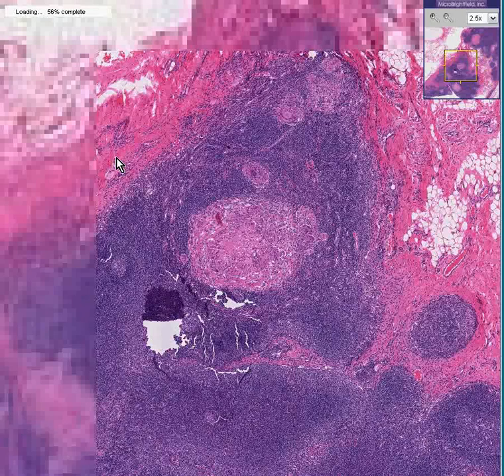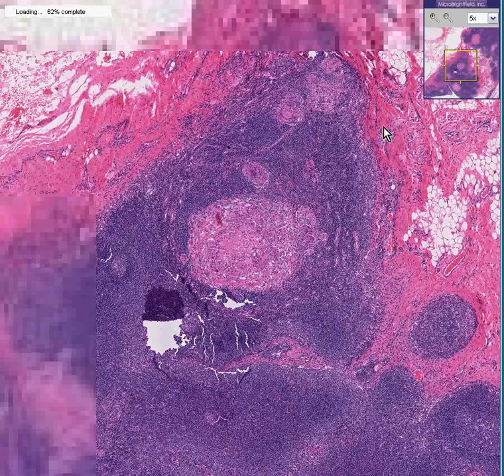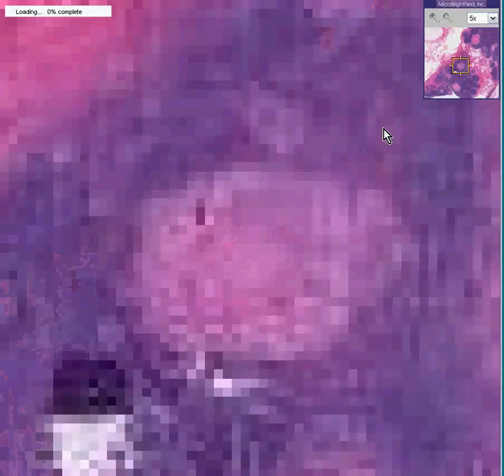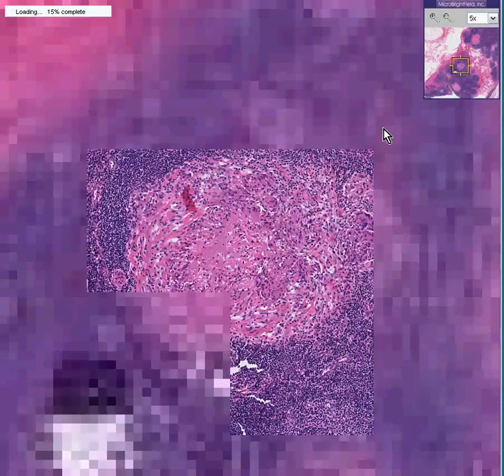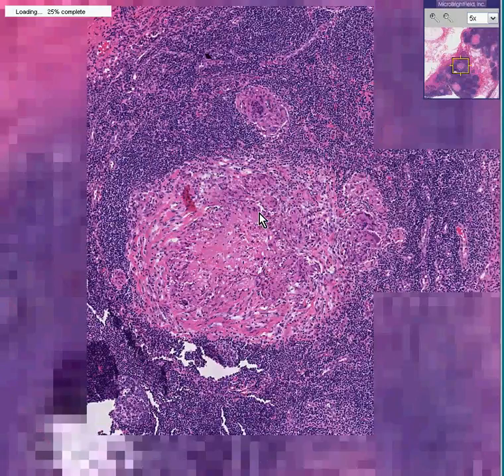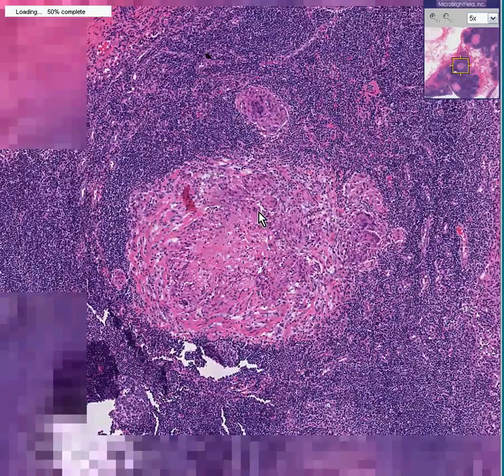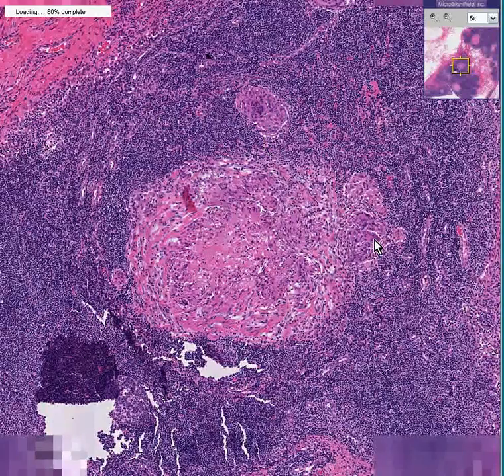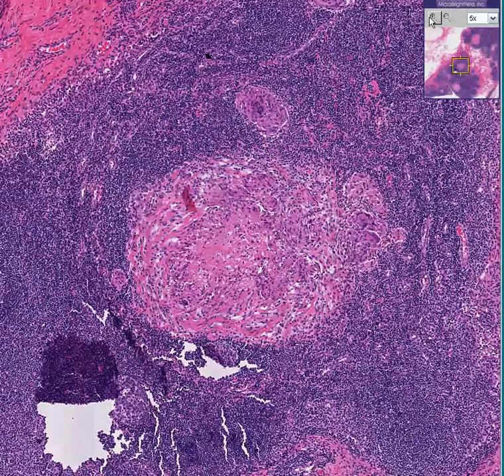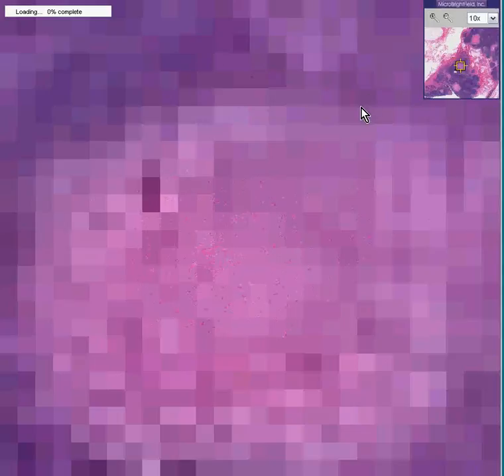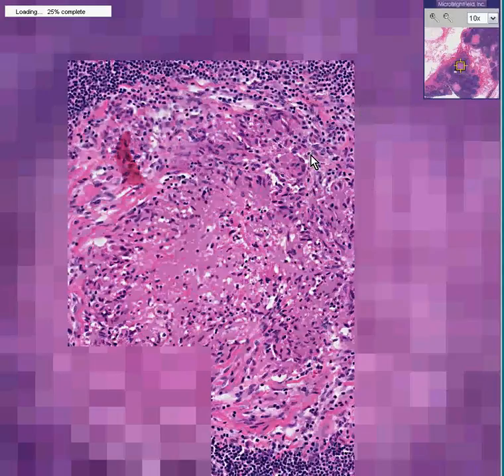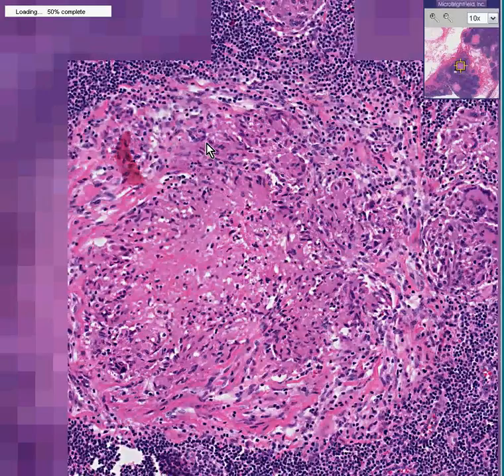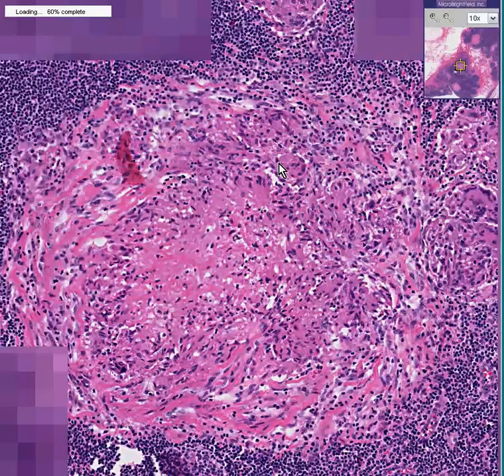I'm going to zoom in a little bit. You could see giant cells — even at this stage, you could see them here and here. Here's a giant cell, here's a giant cell, here's a multinucleated giant cell.